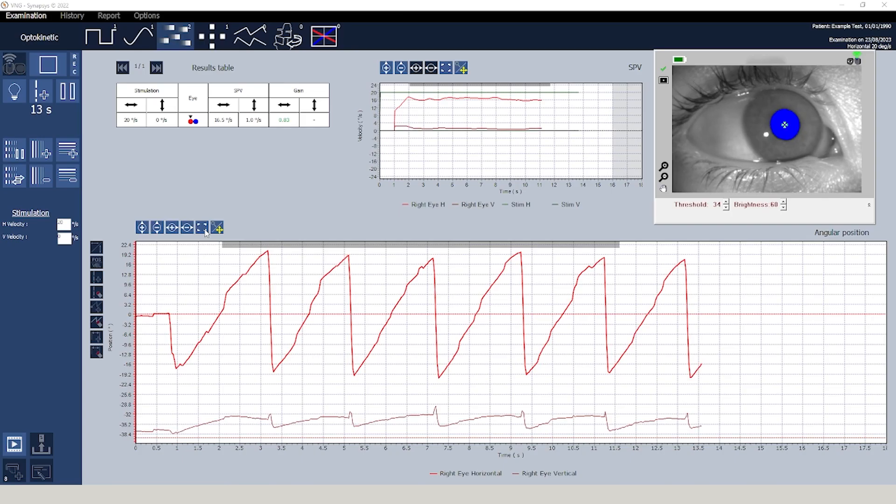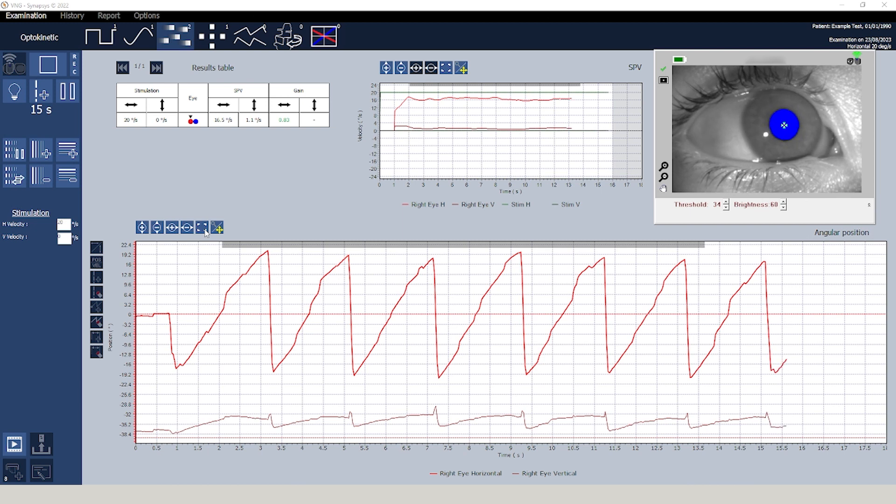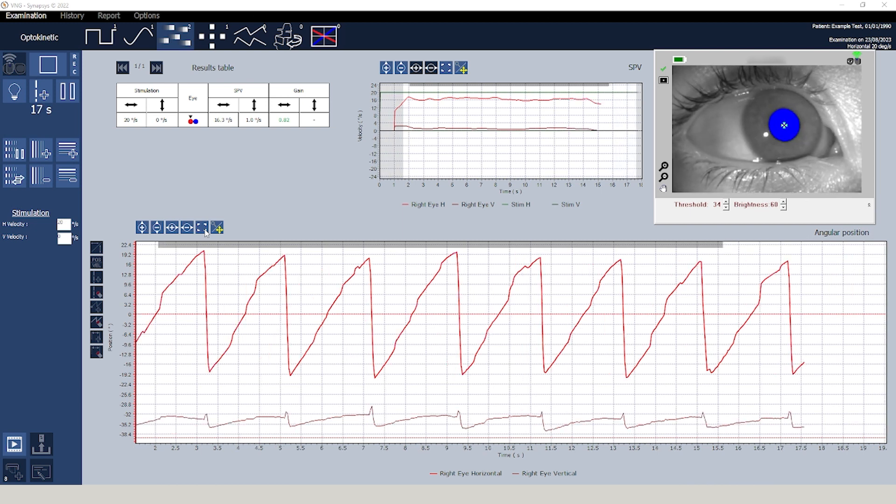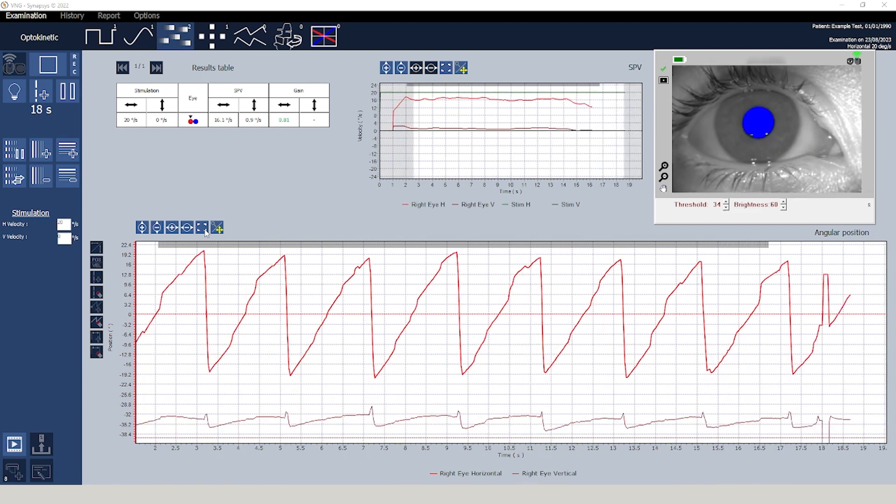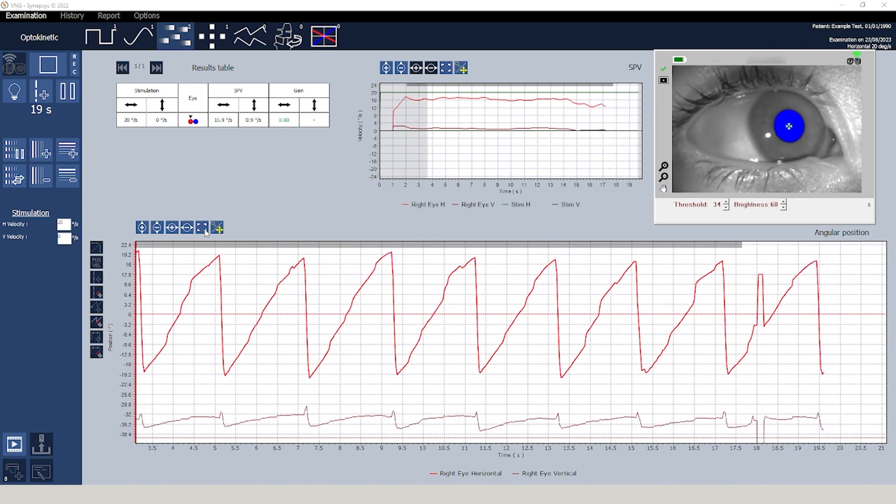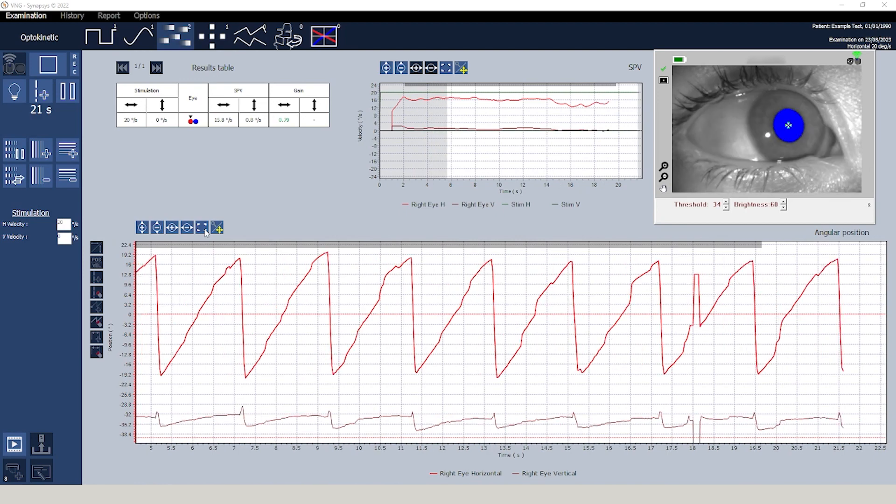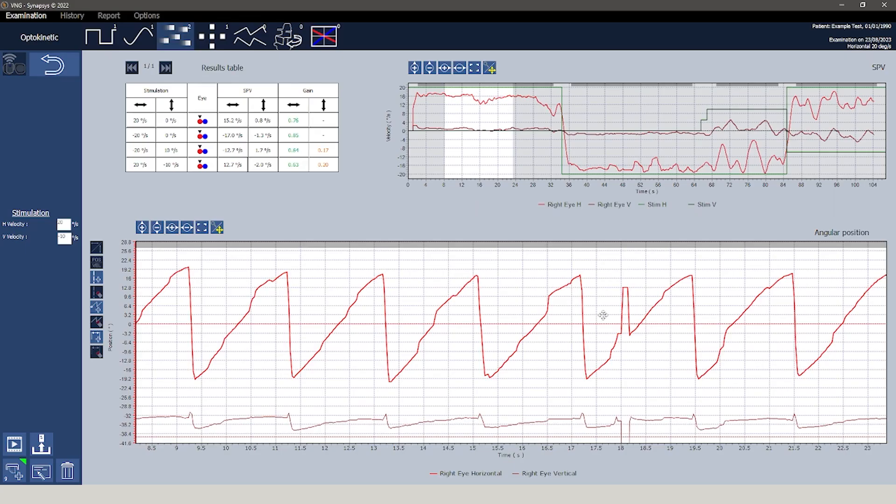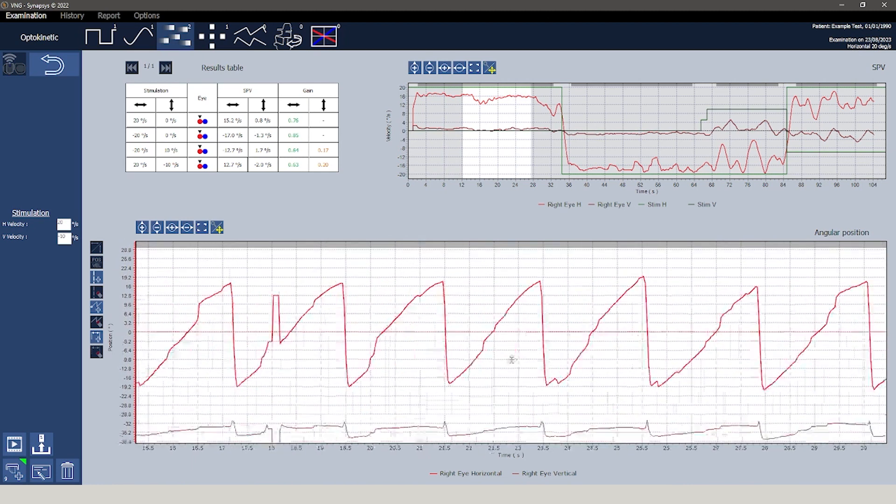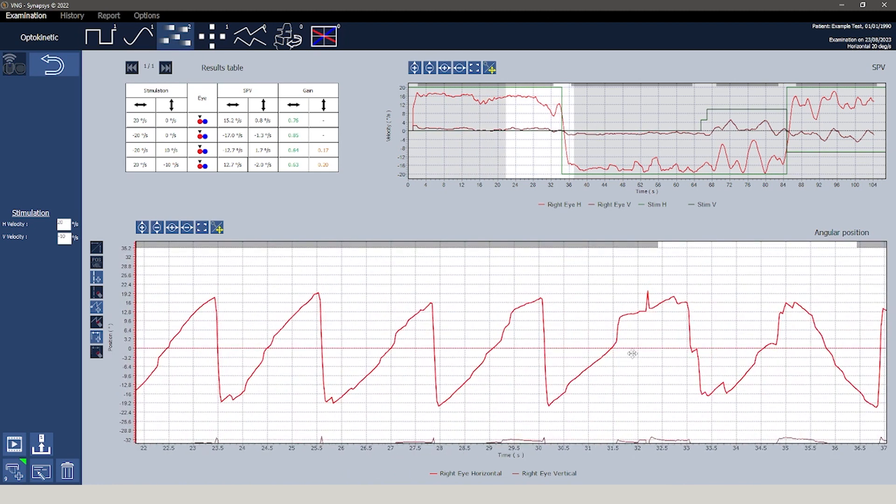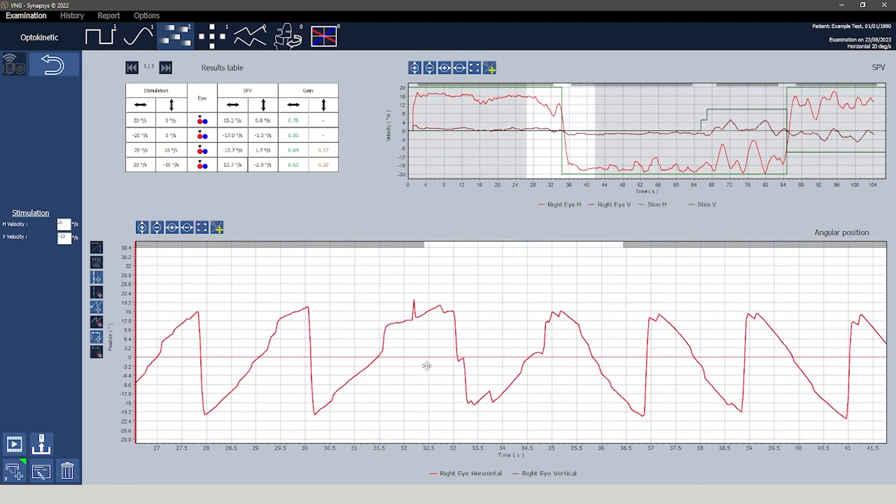The angular position graph at the bottom presents a detailed visualization of ocular movements relative to the target's movement. In the upper right corner a graph illustrating the slow phase velocity for both eyes and directions is displayed.